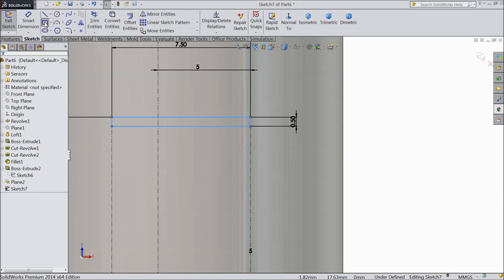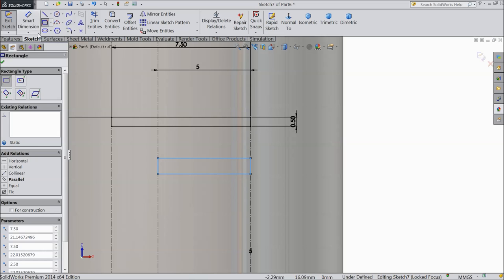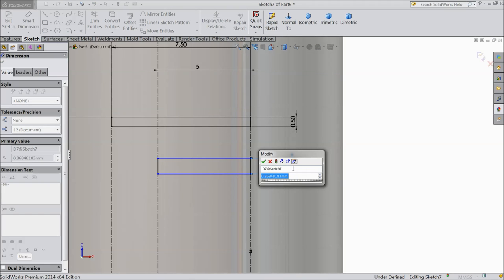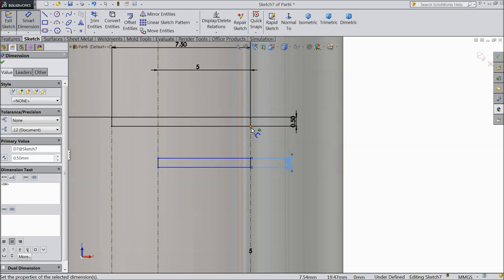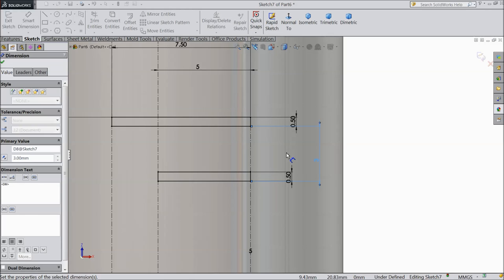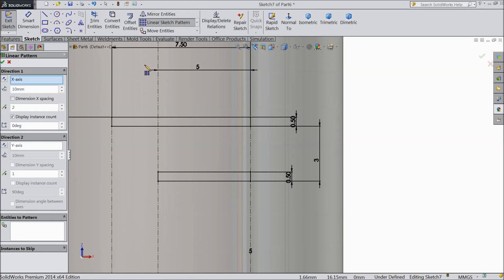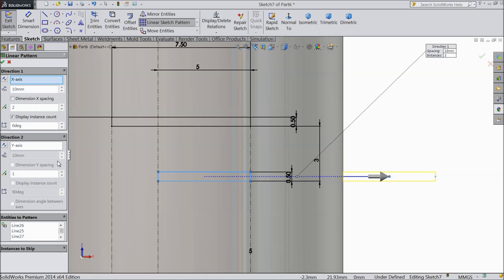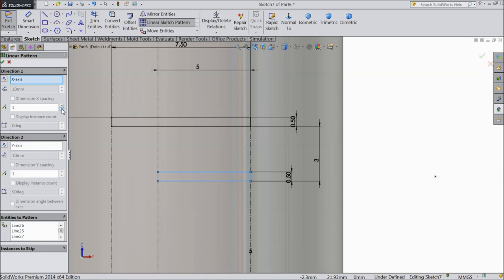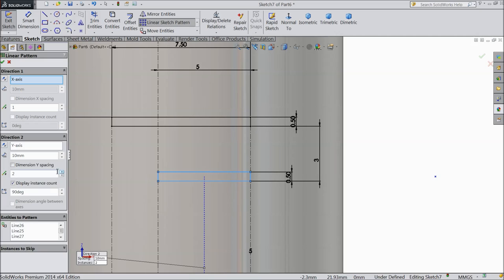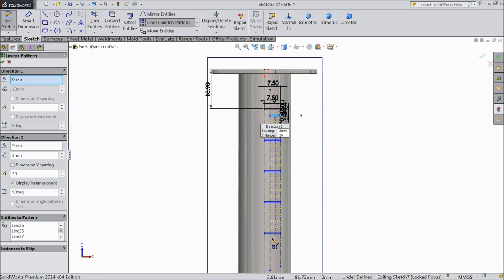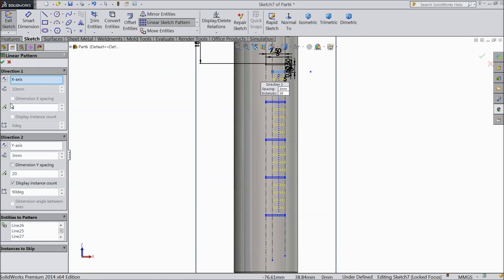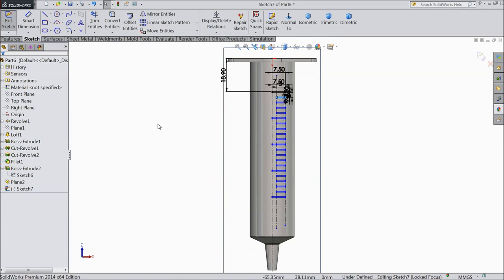Now here select corner rectangle and draw some more rectangles — 0.5mm, and the distance from here to this end 3mm. Now choose linear pattern. Select all four lines, X axis keep zero, Y axis keep down, make the distance 3mm, and we want to make up to twenty items.